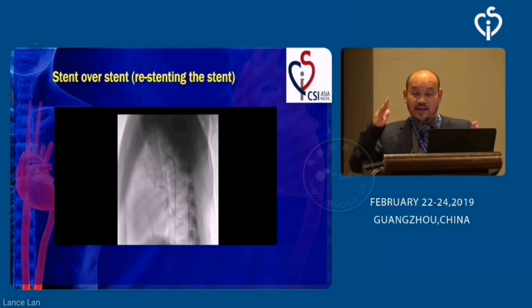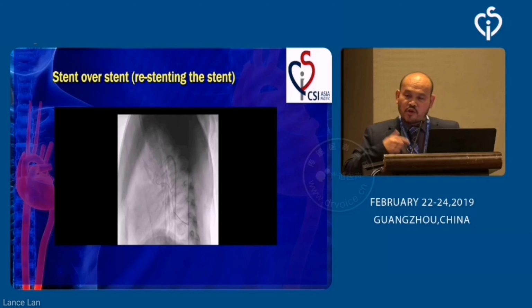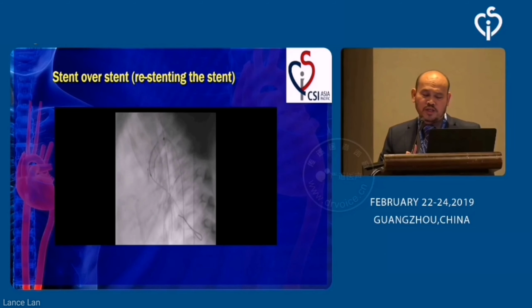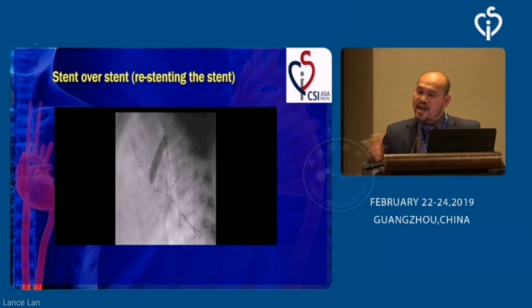Of course, we measure the length, the allowance from the ampulla up to the pulmonary artery, so we were able to do a restenting, a stent-in-stent procedure, in this patient. So here's the overlapping stent, and we maximize the pressure up to 4.2, so there's a good apposition of the two stents and minimize the risk of embolization and migration in this patient.